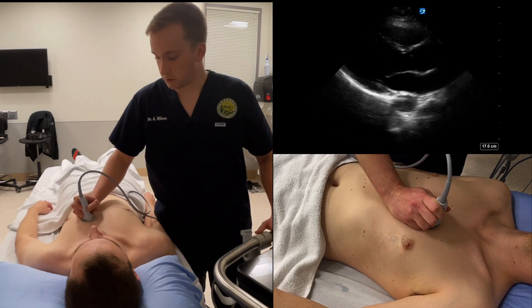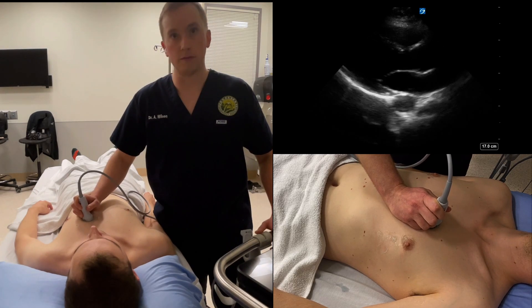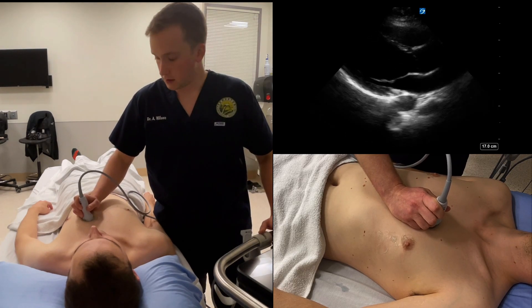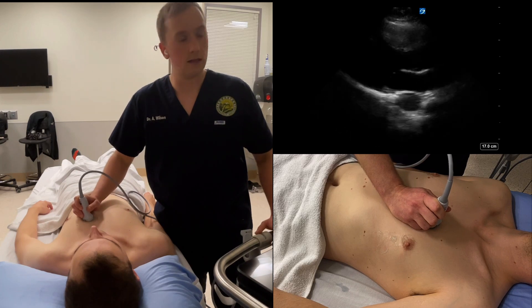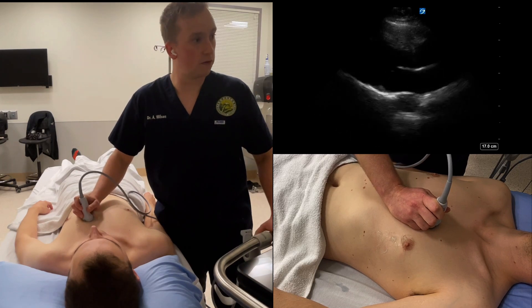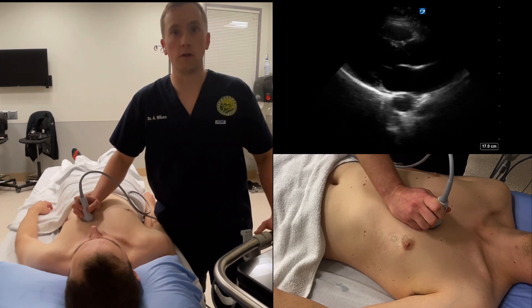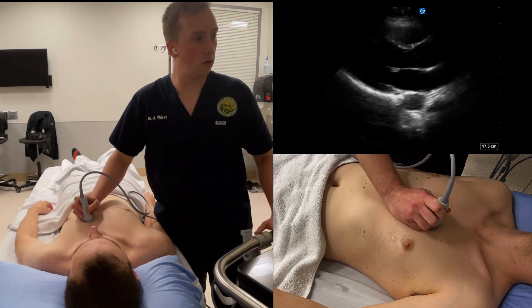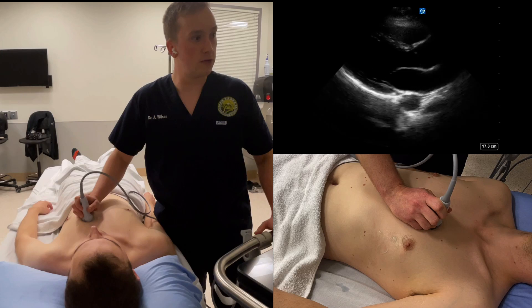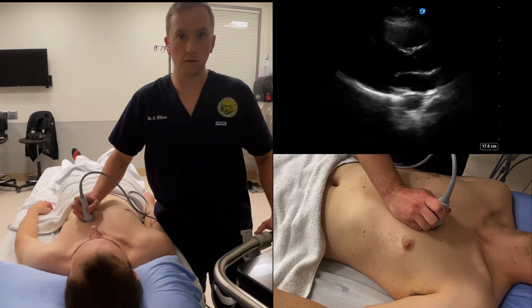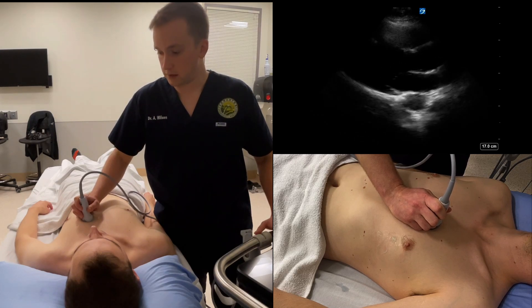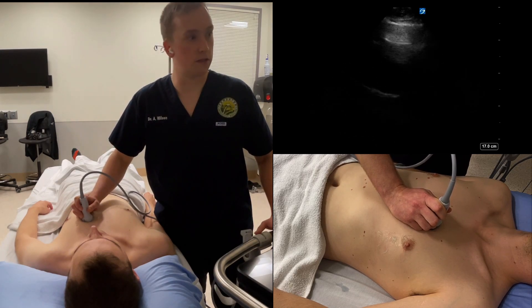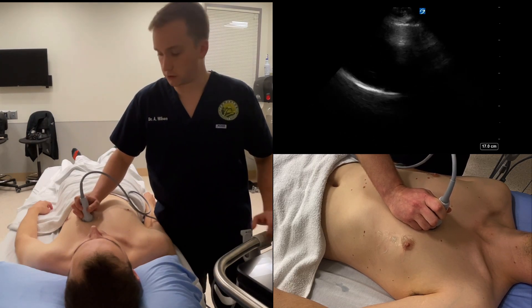However, you're going to have the probe marker towards the patient's left shoulder. Practically, this can be obtained by first getting a parasternal long axis and then rotating the probe, with the image centered on the mitral valve, such that the marker faces the patient's left shoulder.